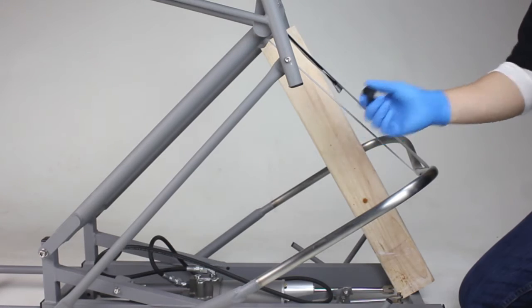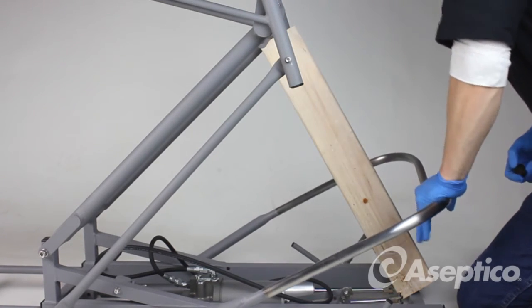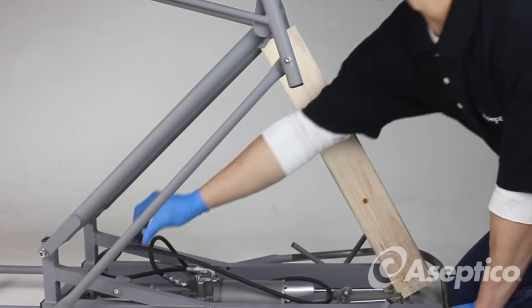With the rubber stopper in hand, unstrap, push down on the foot lever, and install the rubber stopper.